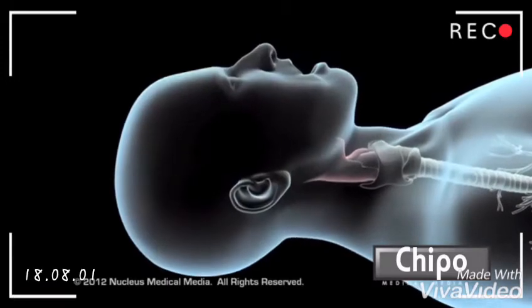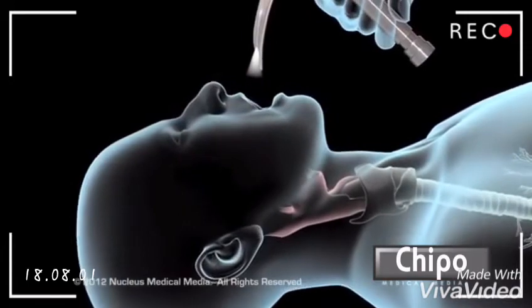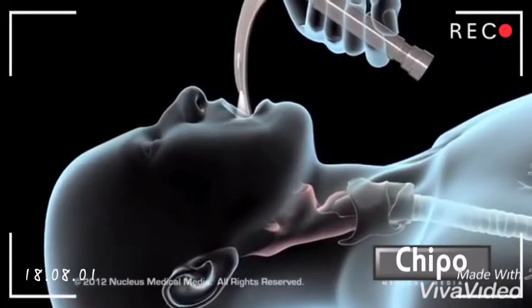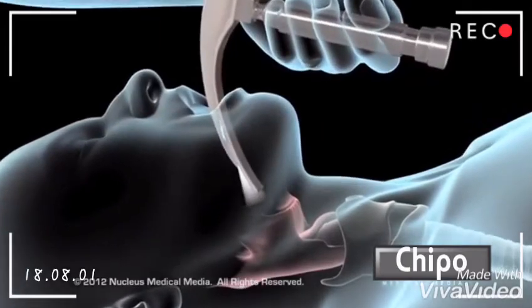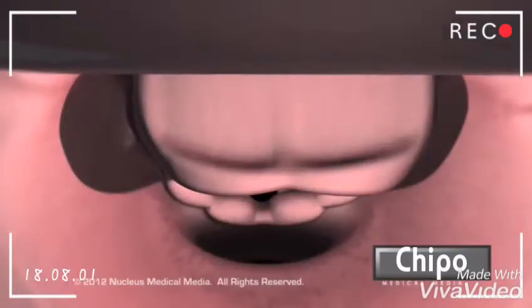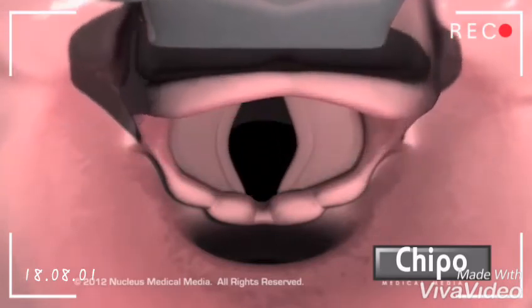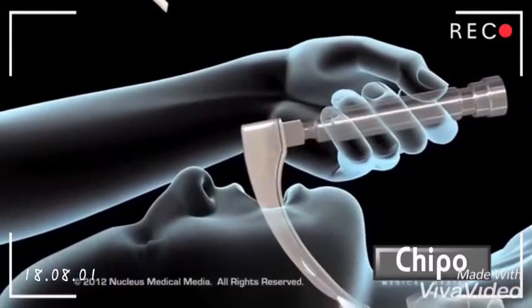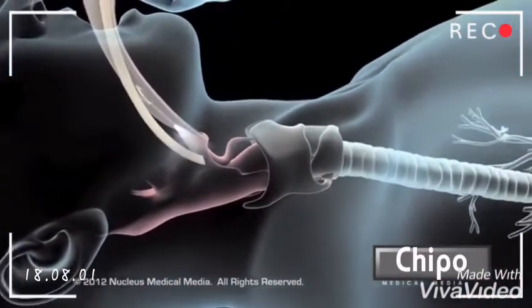The head is tilted back slightly and the laryngoscope is inserted through the mouth and down into the throat, taking special care to avoid contact with the teeth. Using the blade, the epiglottis, a flap of tissue protecting the larynx, is gently raised. Then the tip of the endotracheal tube is advanced into the trachea.